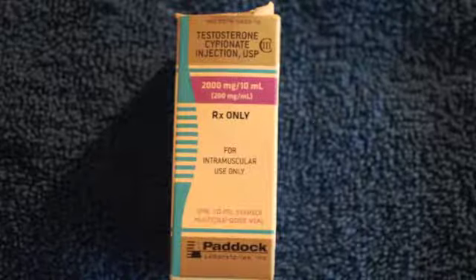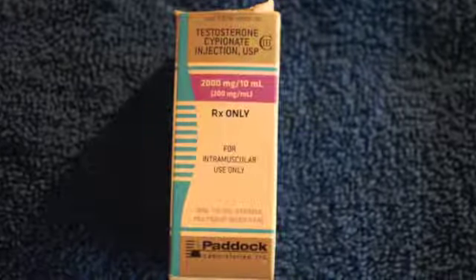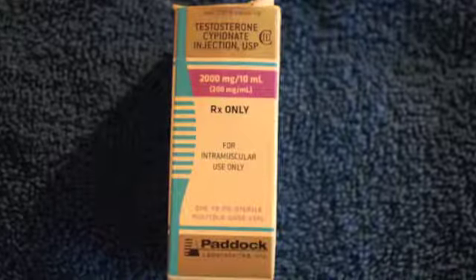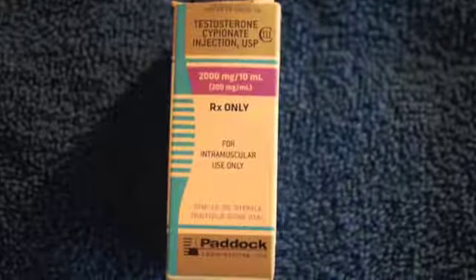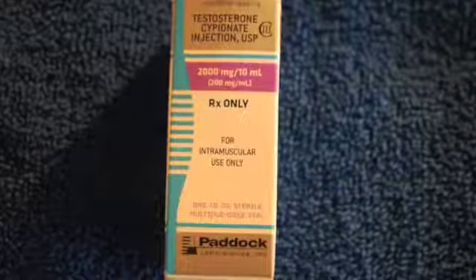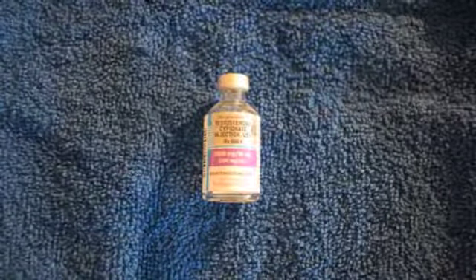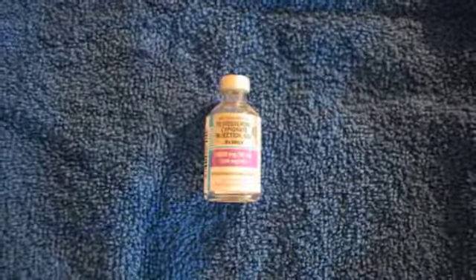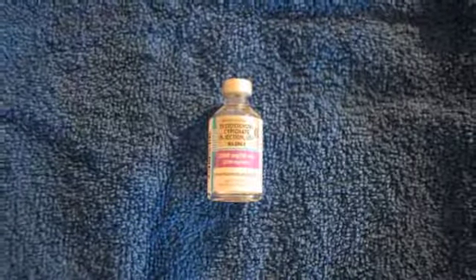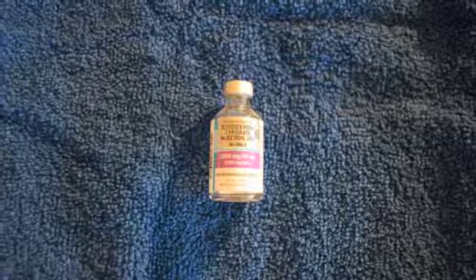Your testosterone will typically come in a box that looks like this. Inside the box will be a bottle. However, the dosage instructions are typically recorded on the box, so please do not discard this. Inside the box will be a bottle of testosterone. The typical concentration that is used is 200 milligrams per ml. Please handle with care so that you do not break the bottle.